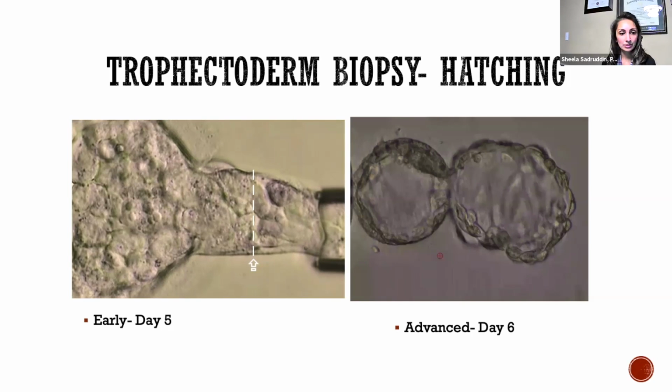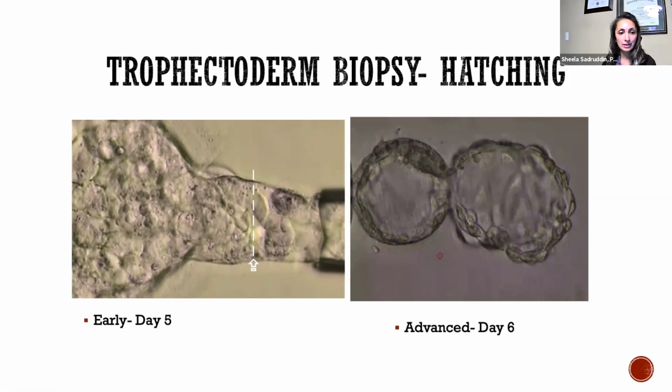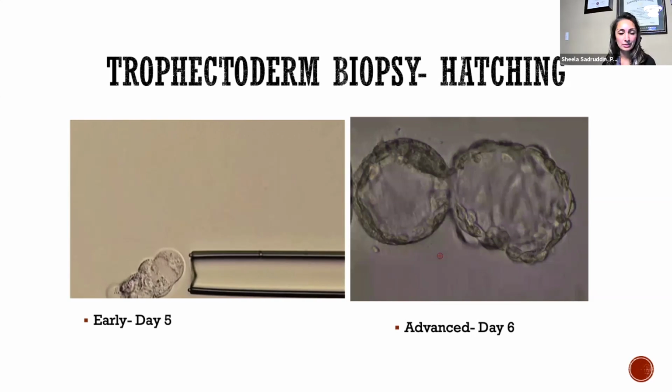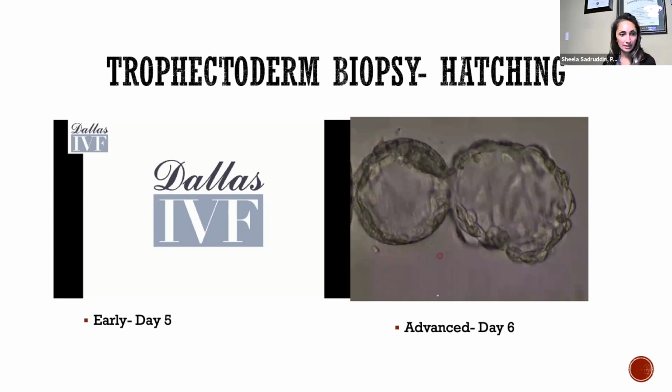And as the cells are being stretched out and the laser is hitting right at the junction points, the tearing of the tissue is easier, it's simpler, and it's much quicker, which is why you get this notion of day 5 embryos are easier to biopsy. So you want the bulbous cells, as you can see here, you want them alive, certainly, and you want them not flat and grainy, so that way you can load them easier.